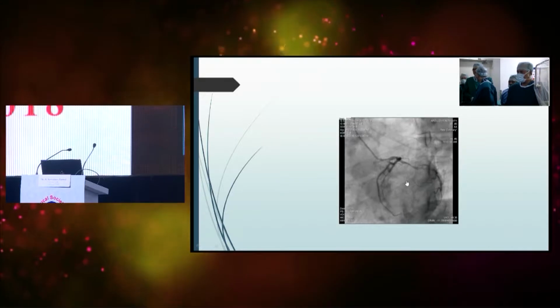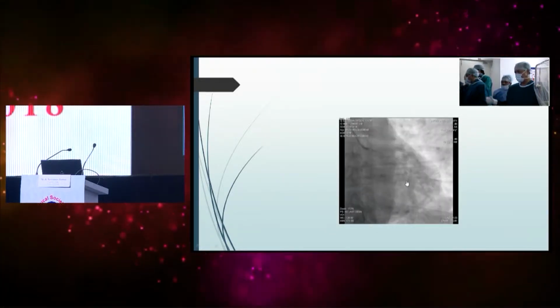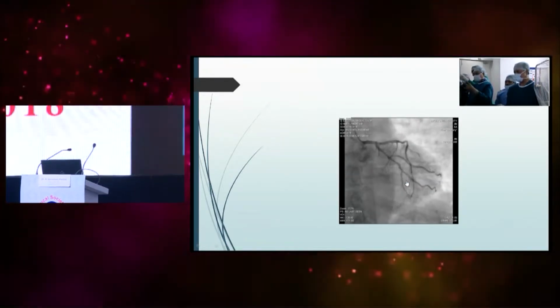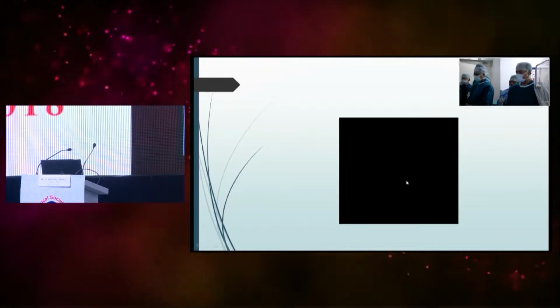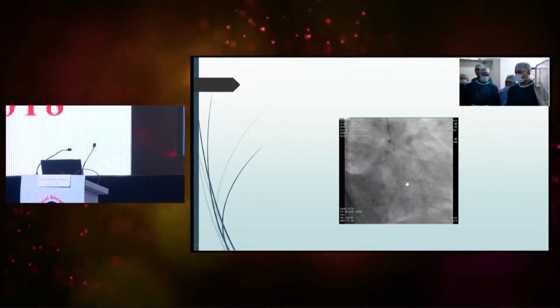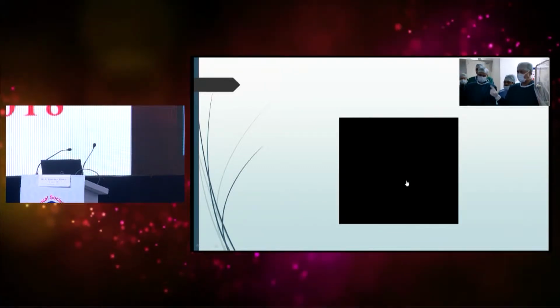Go to the left. Can you see the angio film? That's the left coronary shot. Can you see this left main? There's a left main bifurcation stenosis at the bifurcation site. The stent in LAD is patent, and there's a significant block before the bifurcation.